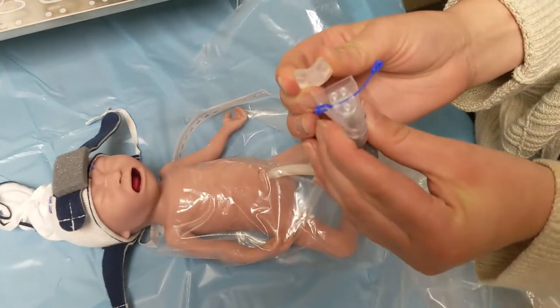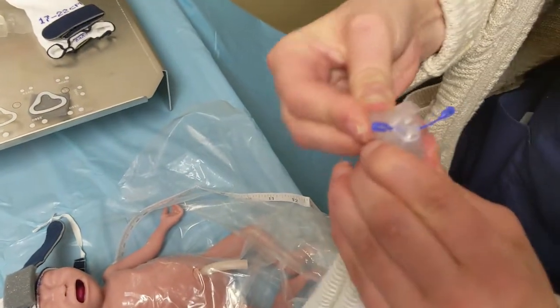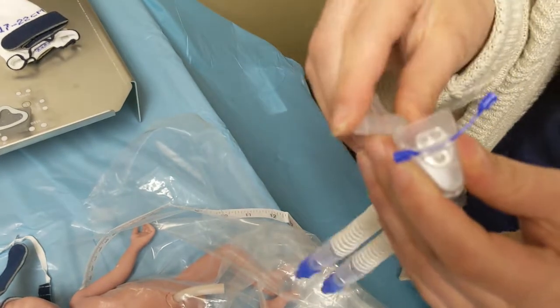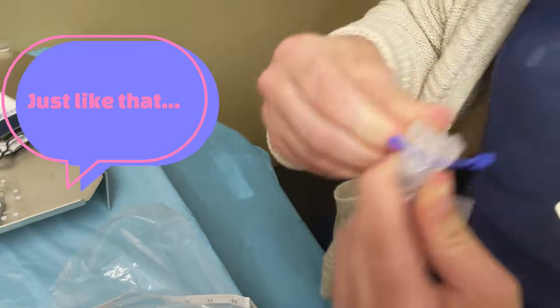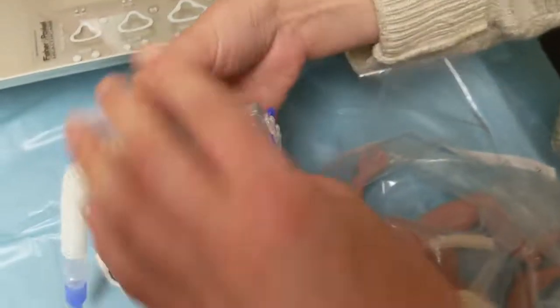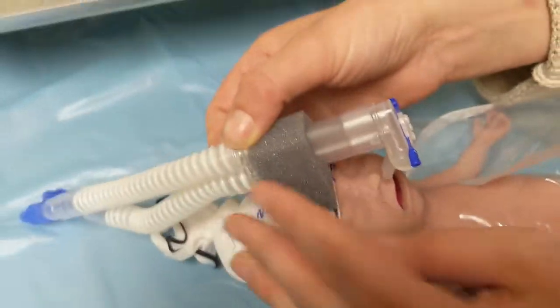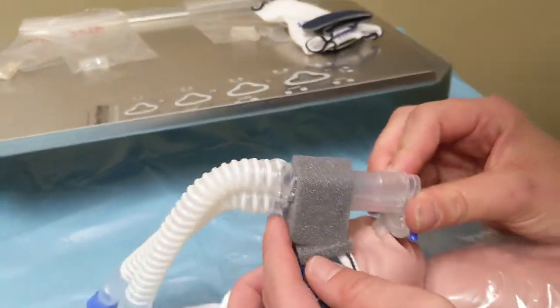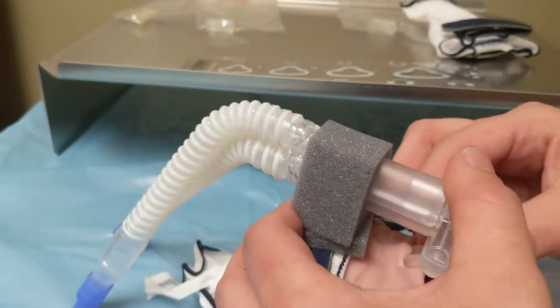To put this on can be sort of tricky, but you want to fold it in. It does require an assistant for this part, but you'll put those prongs into those nares, and sometimes you might even have to finagle it a little bit.